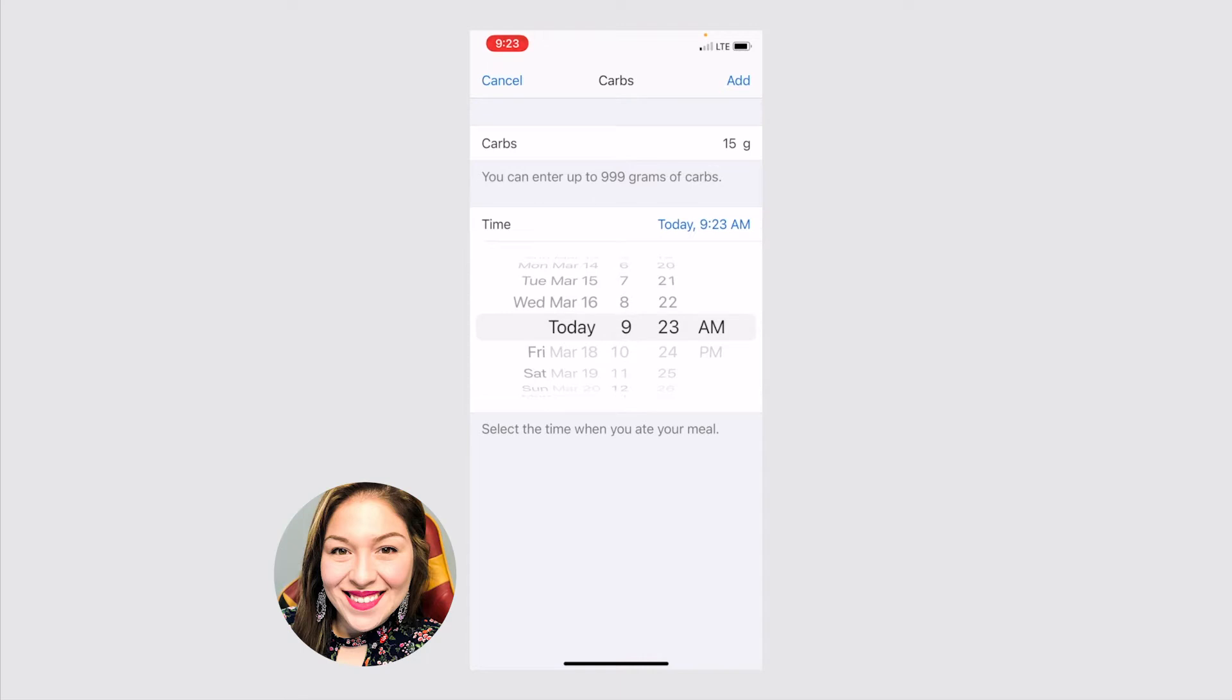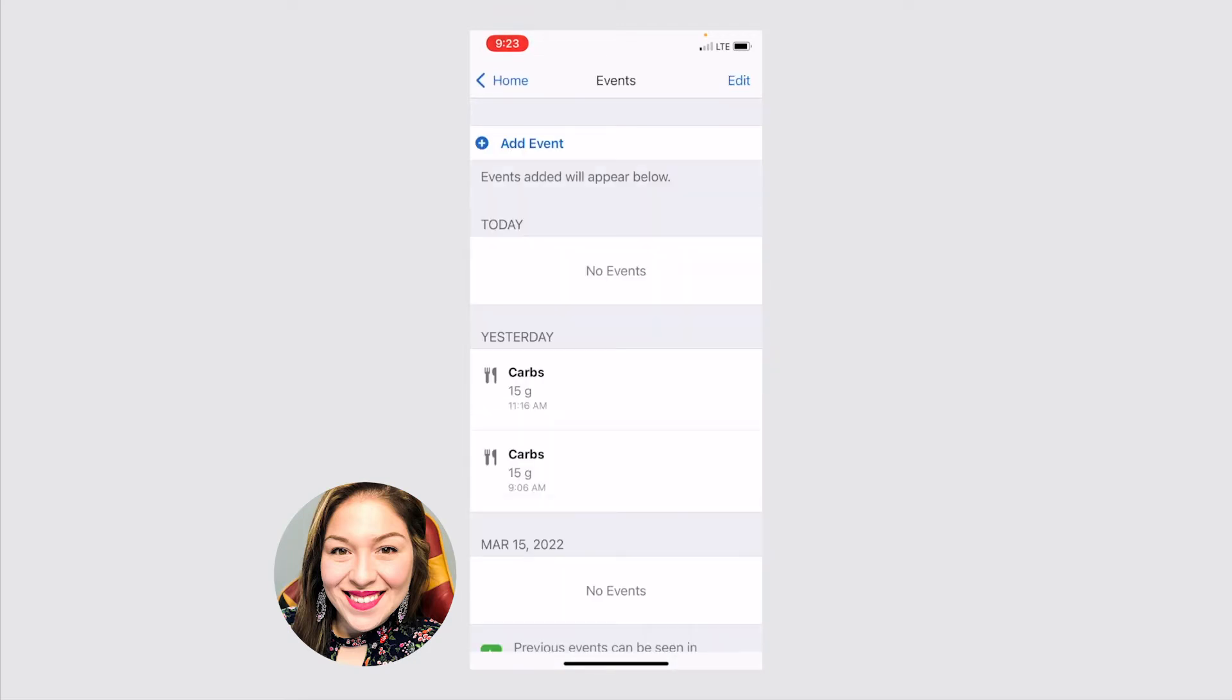But you can adjust the time. If again, you forgot to log it right when you ate it, you can always go back and add it in later. This is really helpful. And it shows you yesterday, the past few days, what you've logged. So you can go back and look at it.